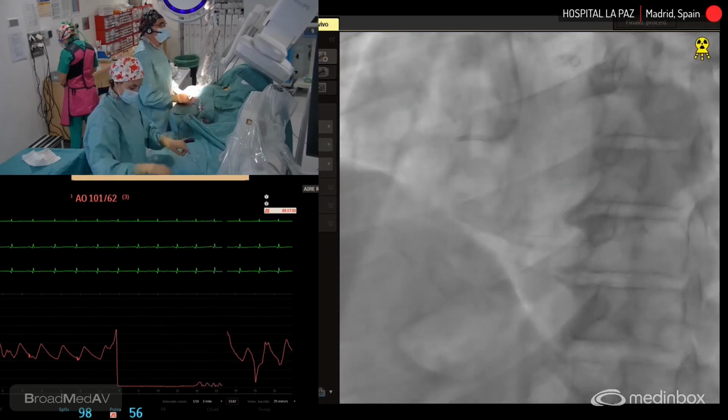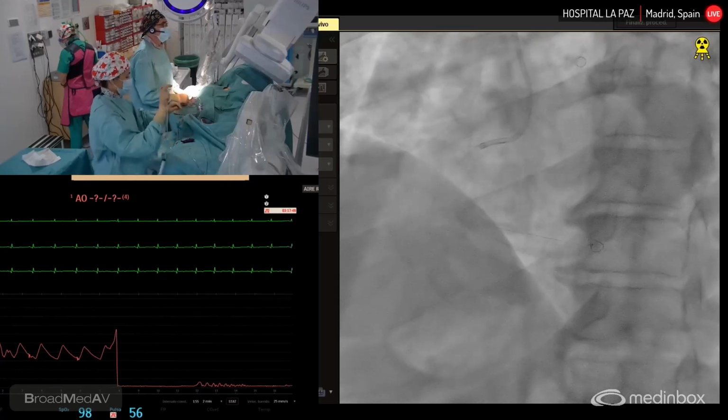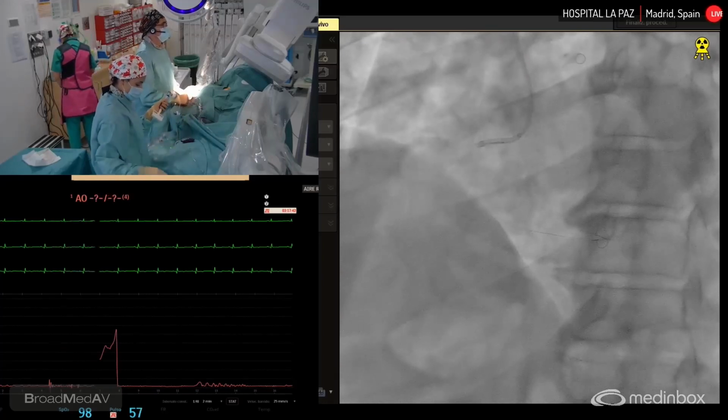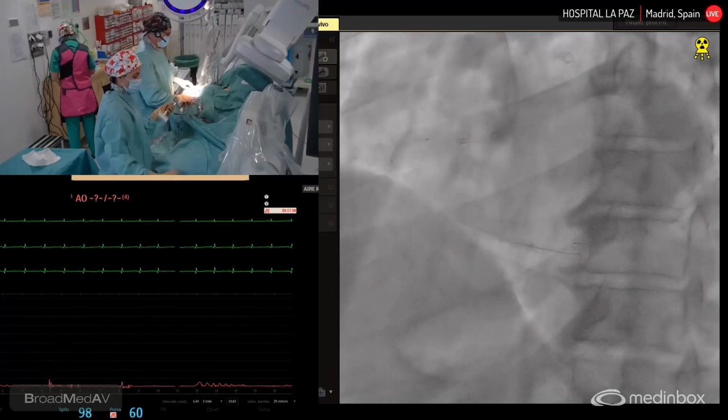You have just answered the second question about our experience in intra-stent restenosis. That is very good too, due to underexpansion more than anything.